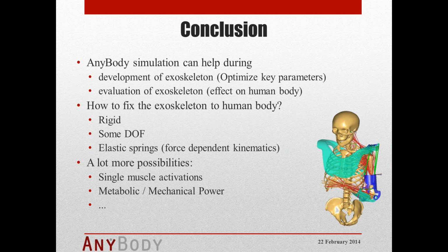There are many different ways, from really rigid connections to just connecting some degrees of freedom, having some carried by the human, having some carried by the exoskeleton. We also have done some elastic springs or elastic elements using our functionality that we call force-dependent kinematics.